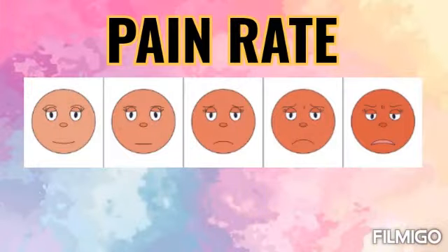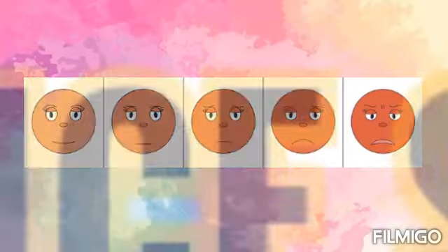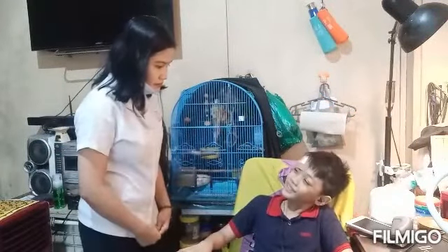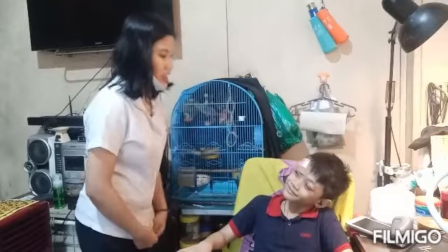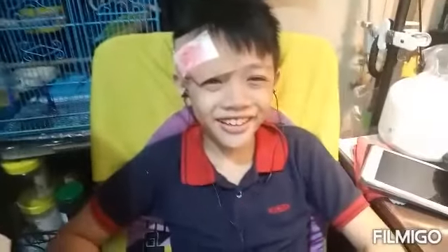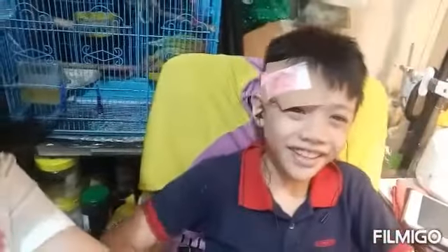Let's assess the pain rate of the newly arrived patient. Let's go! Hello, my name is Janice. Can I know your name? I'm Nathaniel Drew. Can you tell me why you are in pain? Oh, because I fell from a tree and I have this wound in my head.